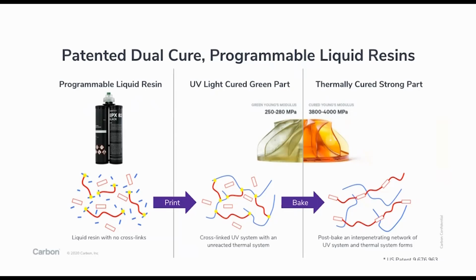So you look at the resin cartridge on the left and you see a two-part resin, much like you'd be experiencing in a variety of thermosetting chemistries: epoxy, cyanate ester resin, polyurethane thermosets. And we separate them from the photochemistry. So as we move from left to right, we have the resin, it's mixed.